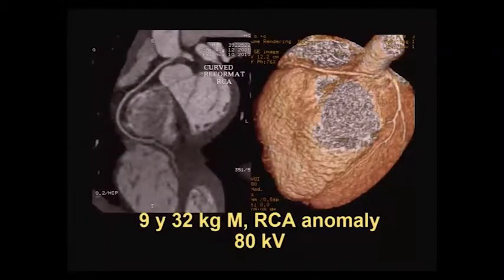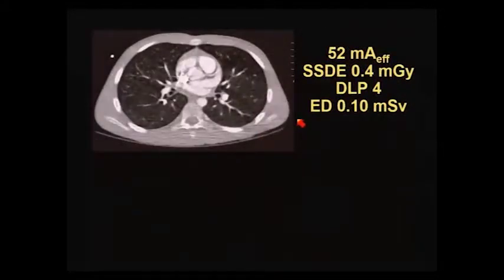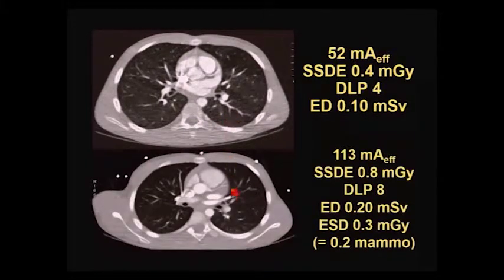That is quite remarkable. And so now with the flash CT scanner, we can see in this patient with an anomalous coronary artery. Yes, we did acquire this image, and it was one of the lowest doses that we ever recorded, 0.10 millisievert. And we found this was not quite acceptable. It was too grainy. We couldn't really tell the takeoff of the coronary artery. So we just called the patient back for another scan.